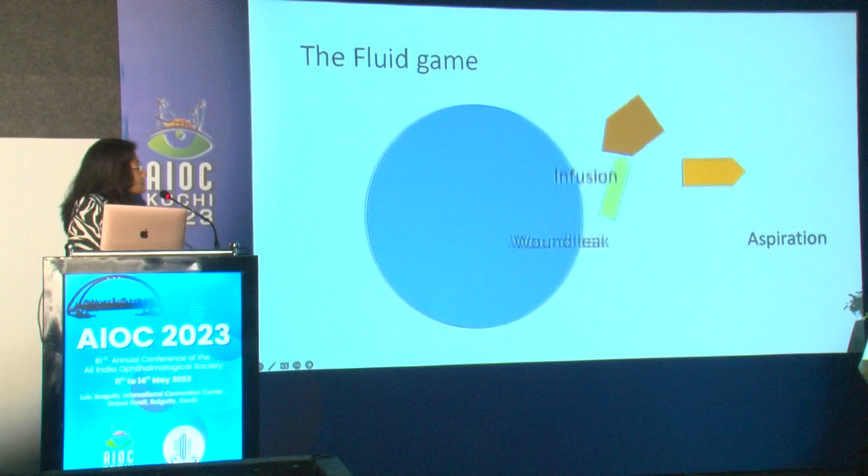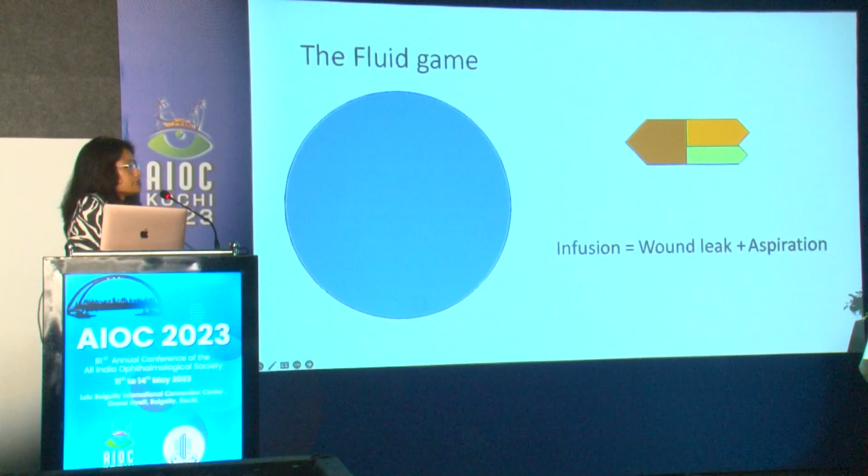So to maintain the balance and the stability of the anterior chamber, the fluid entering the anterior chamber must be equal to the fluid exit, so that we can have a normally pressurized, stable anterior chamber. But practically, it doesn't happen in absolute terms because a small amount of microfluctuation always remains.